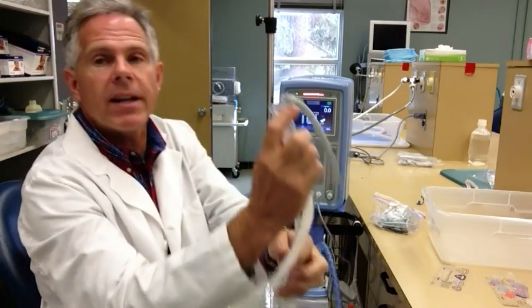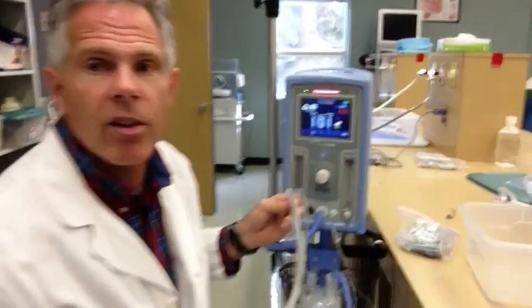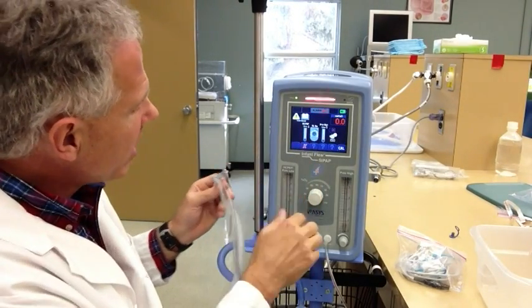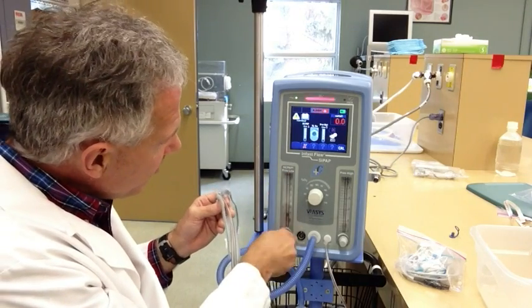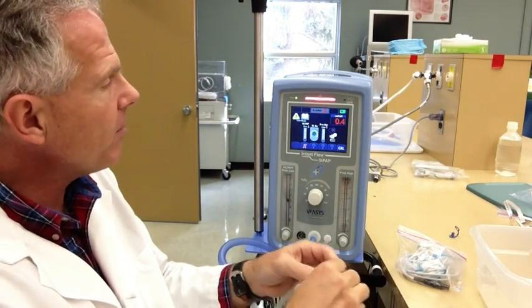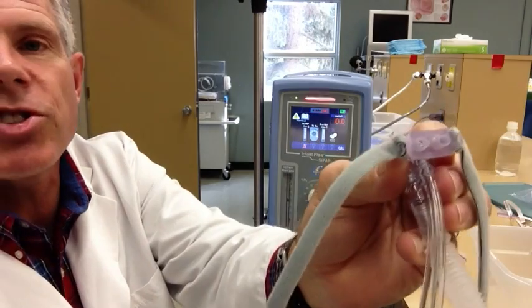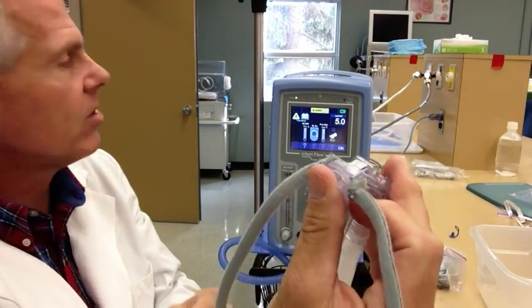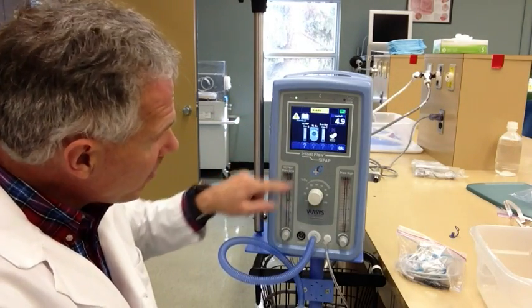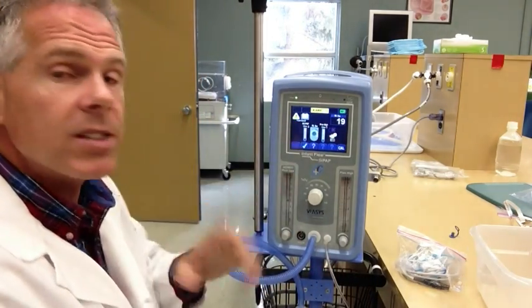We'll need our patient connector right here. It's asking me now to do my checkout - it actually prompts you to do your checkout. So the first thing we want to do is check our nasal CPAP. I'm going to set the nasal CPAP flow to 8 liters per minute. Now, when I occlude our little flip-flop gate where it goes to the patient - I'm just going to put in a little patient connector there, a large nasal prong, and put my fingers over that. You'll notice that this pressure is reading 5, which is just what I need for the checkout. So at 8 liters per minute, I'm getting plus or minus 1 centimeter of water pressure - 5 centimeters of water pressure built up in my circuit.